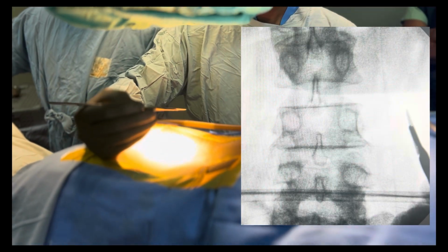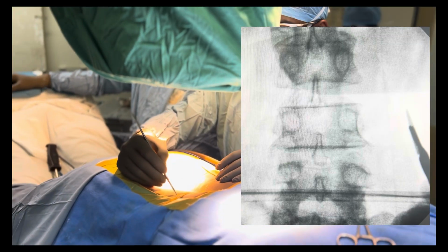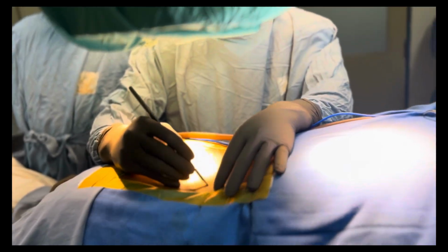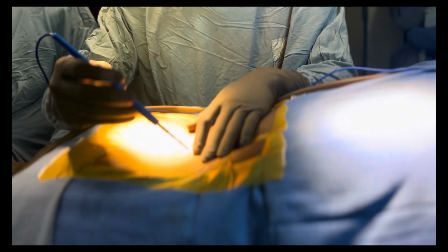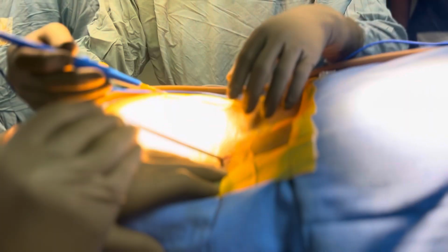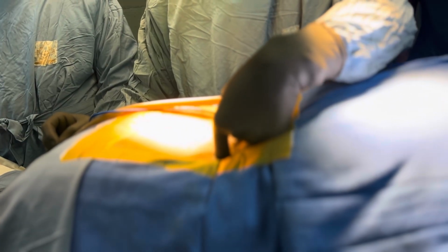I have taken a number 15 knife and I am checking on the C-arm where I am. So we are going to take the incision at the tip of the transverse process for the L4 pedicle. This is around a 1 centimeter incision. To avoid oozing, I am going to do a little bit of dissection with monopolar cautery. After that, I am going to confirm with finger dissection whether I have cut the fascia or not. I can feel the transverse process and the facet.